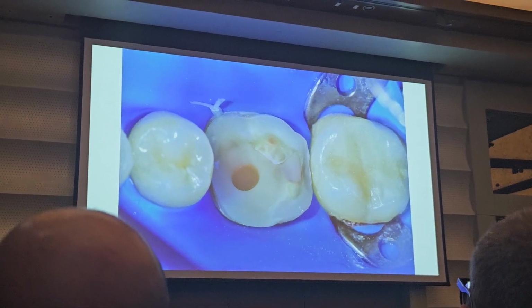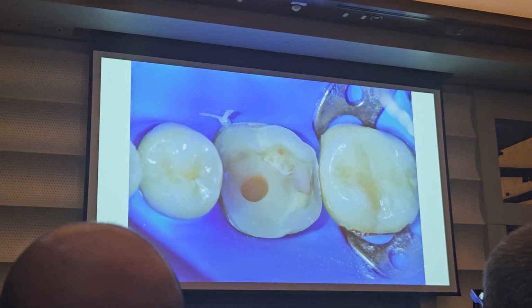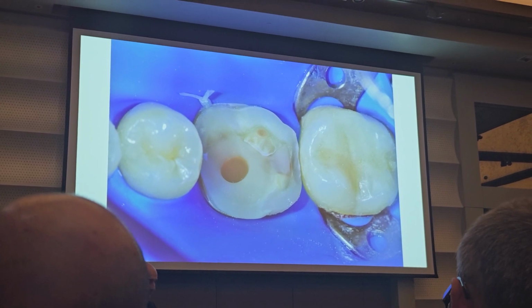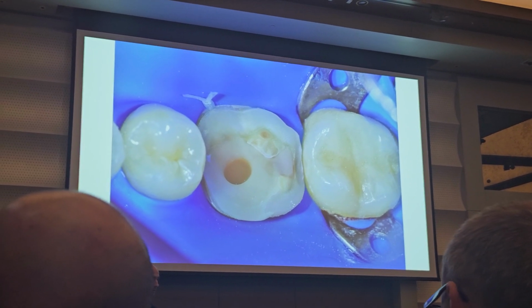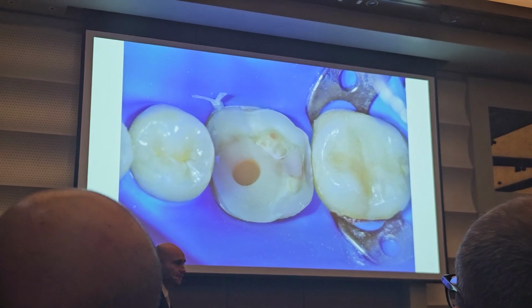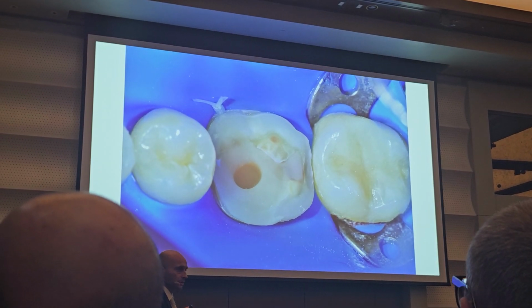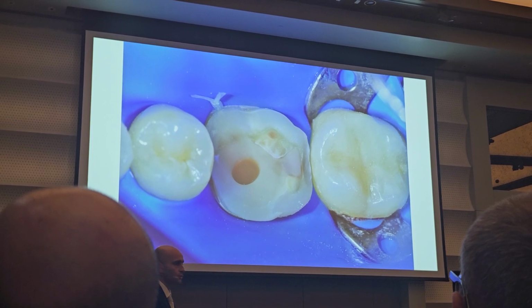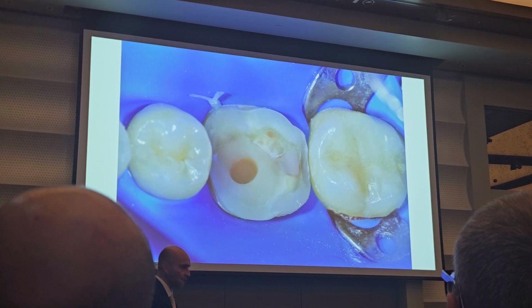I just placed a little hole in the composite of 1 millimeter, but just for the index. So the onlay doesn't slip, I can test the contact area before. Because the other problem, when you use the rubber dam, okay, teeth are pulled out. So you cannot test the onlay under the rubber dam. It's useless, because teeth move under the traction of the rubber dam.